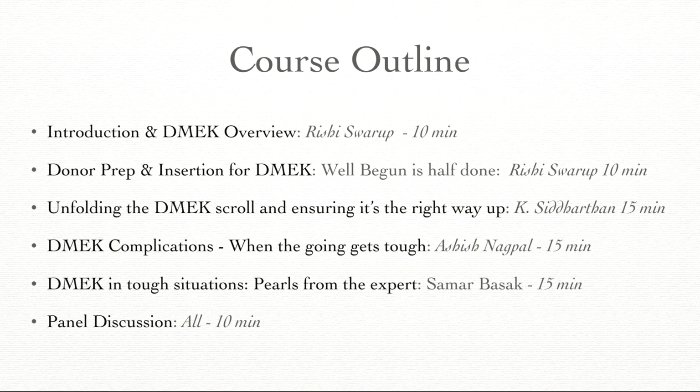Like I said, we'll start with an overview of DMEK and then some points about donor preparation and insertion, followed by a talk on how to unfold and ensuring it's the right way up, some complications, some simple ones and some dreadful ones, and then some tough situations from the expert. Then we'll have the keynote address followed by a panel discussion.